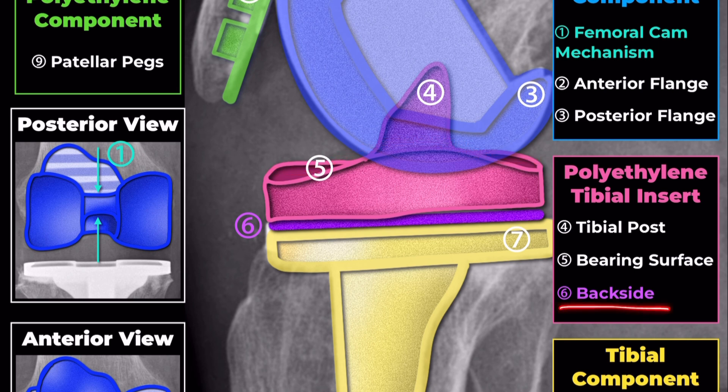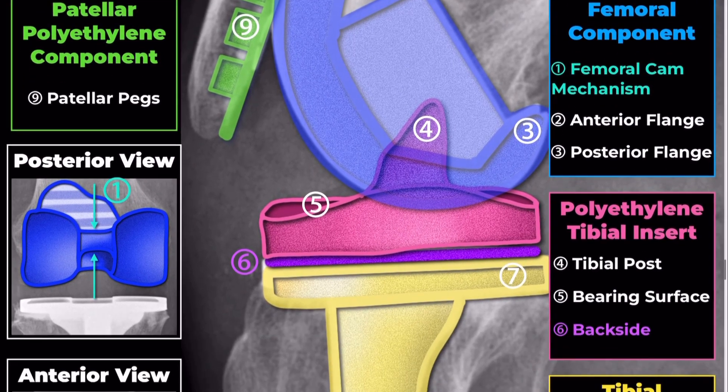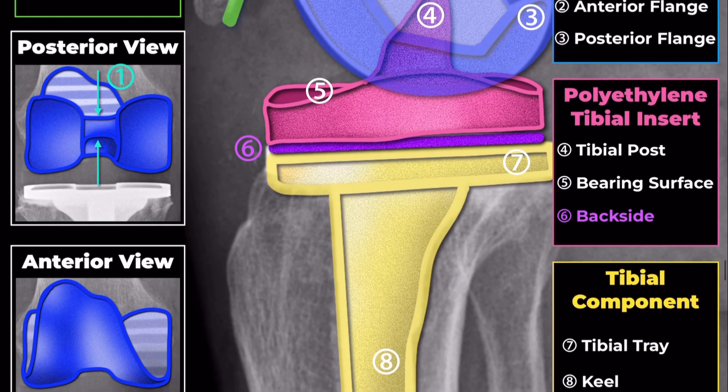Backside: the backside of the tibial insert interfaces with the tibial tray. It must be designed to lock securely into the tray, preventing micromotion and enhancing the implant's longevity.